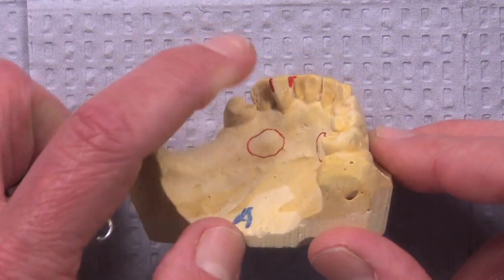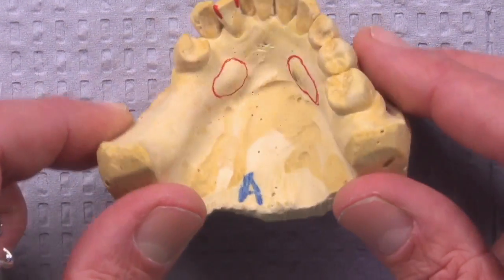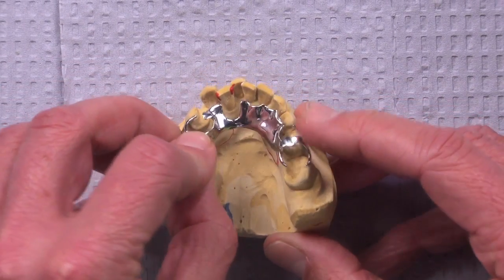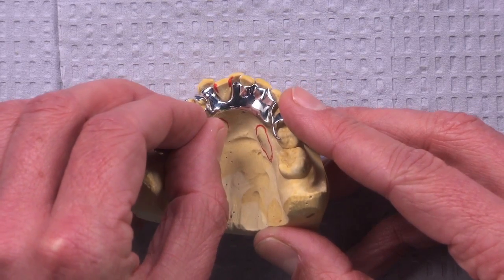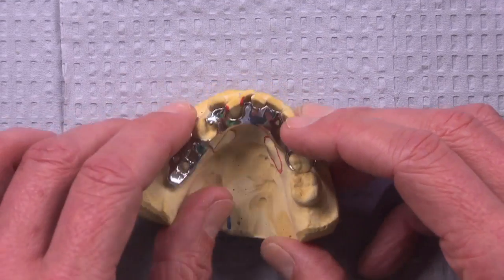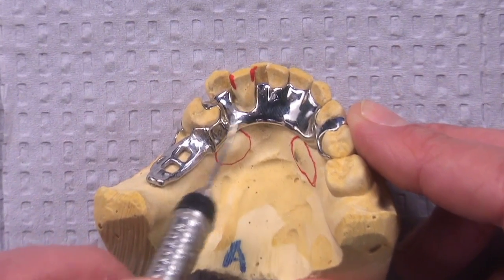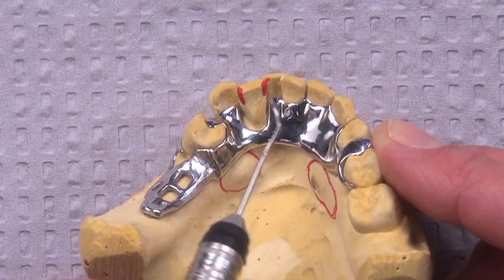They wanted to kind of thin that tooth mesiodistally and make it a little bit more shaped like the neck of that tooth. And you'll see why. This is actually going to be an issue as we take the partial framework and try to put this into place. It's almost difficult. You can see how it's almost scraping the tooth there as we go by there. And I can just kind of wiggle it down into place, and there it snaps down into place. So you can see the major connector has to go down, has to have this cutout in it right here because of the fact that it needs to get around the wider part of the tooth.